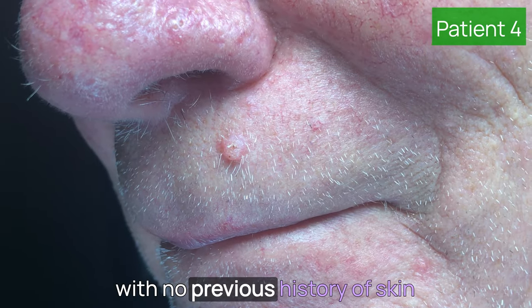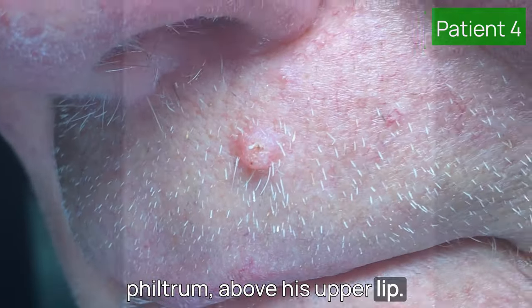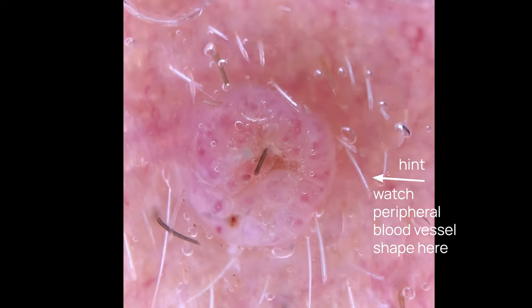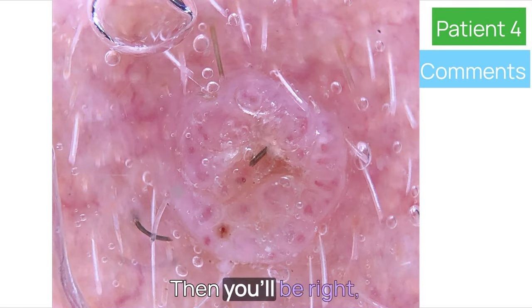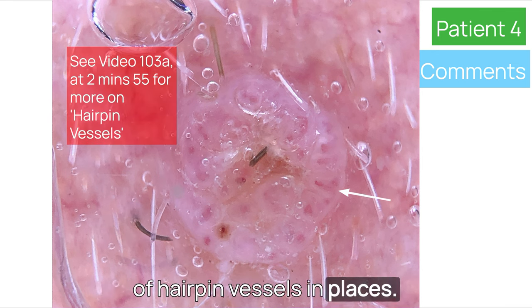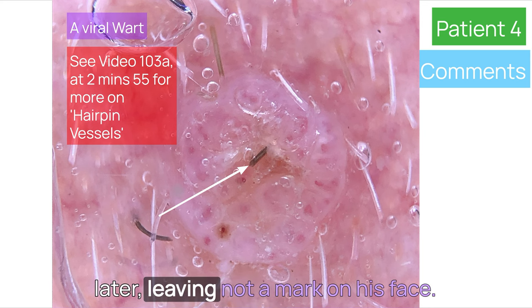This 81-year-old gentleman with no previous history of skin cancer had a pink papule that had grown over the past four weeks on his philtrum above his upper lip. Did you find any BCC structures? No — because there aren't any. Note the vessels: most are dots with a white surround, and at the periphery note a couple of hairpin vessels. So it's a keratinising papule — note the hair follicle. It's a wart. After a 30-second freeze, it dropped off two weeks later, leaving not a mark on his face. Without a dermoscope, I can imagine this being referred as a two-week wait query BCC or SCC.